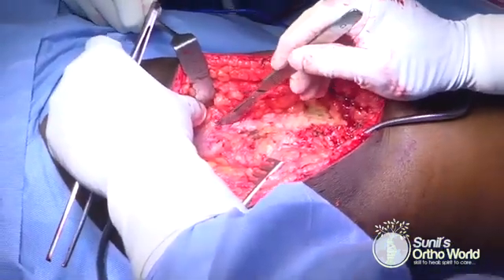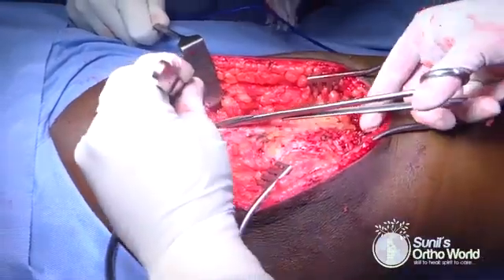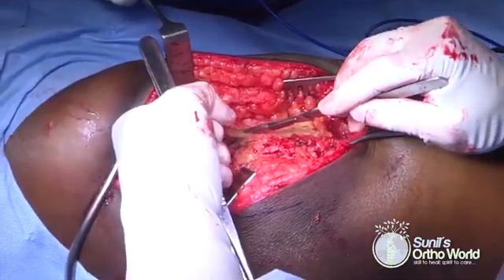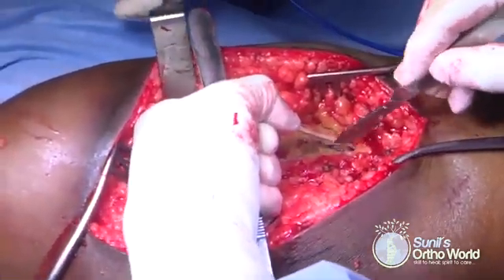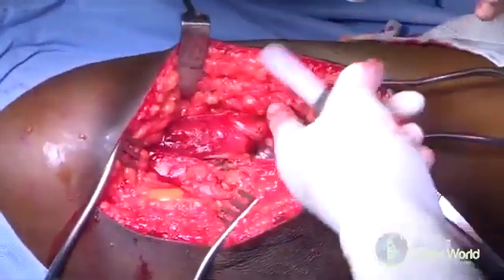The next step is to identify the Gibson interval between the gluteus maximus and the medius muscle. This is best done by starting the fascial incision proximal to the greater trochanter along the anterior border of the gluteus maximus muscle. Once the fascial incision is made, the muscle fibers are gently teased off from the fascia, exposing the underlying gluteus medius muscle.